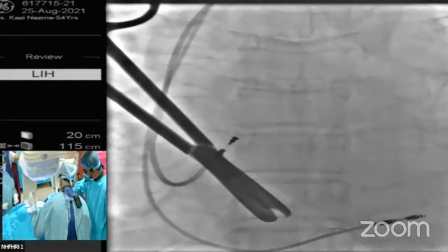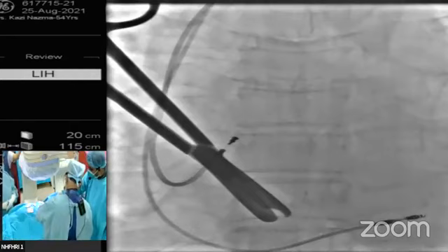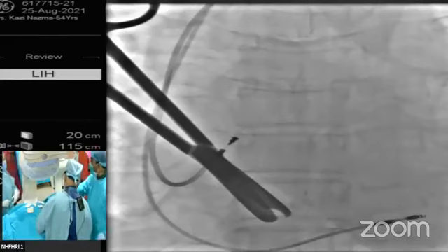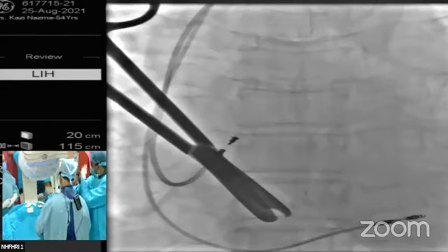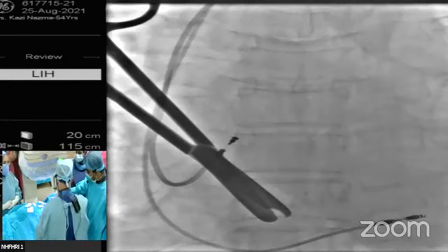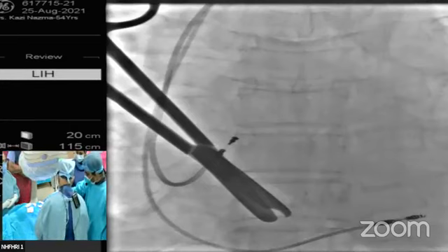Bleeding complication, particularly in a patient taking antiplatelets, exactly the duration is not known. If there is a bleeding complication, what do you usually do? Most effective is the pressure. And cautery also sometimes may be helpful.